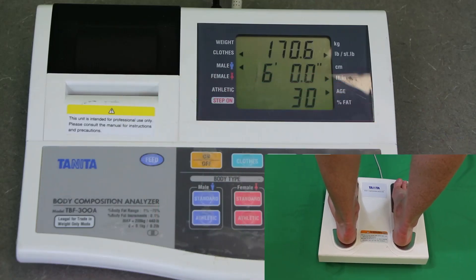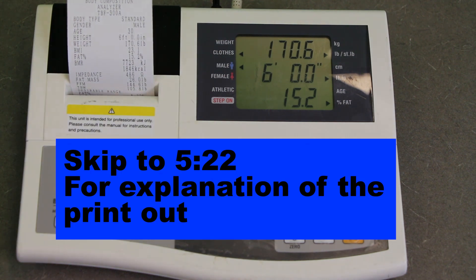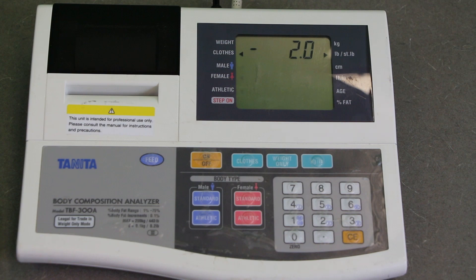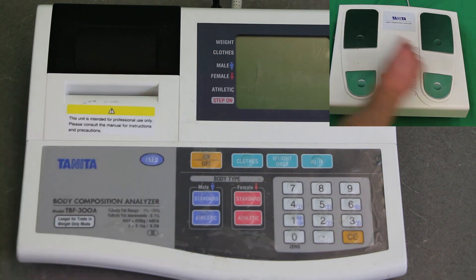You can see the weight starting to come up. Those circles on the display will go away whenever the machine is finished processing. The machine then prints out a receipt that has all the information you need. When you're all done, simply hit the off button and make sure you clean the system again using an alcohol swab.